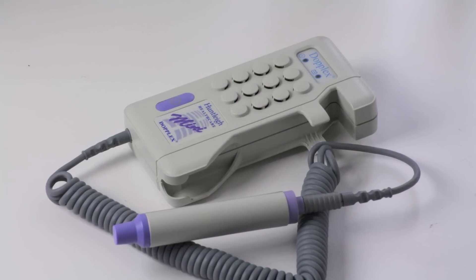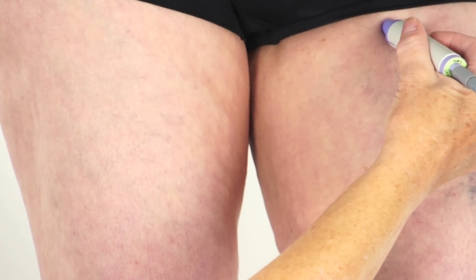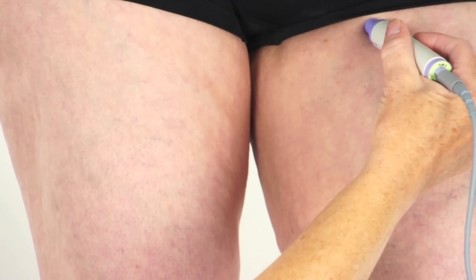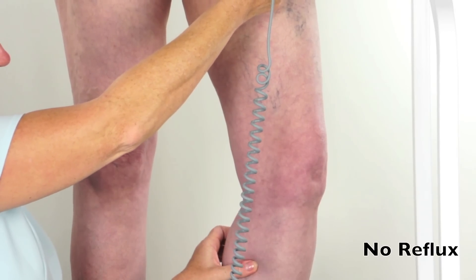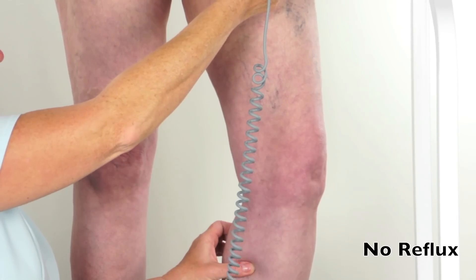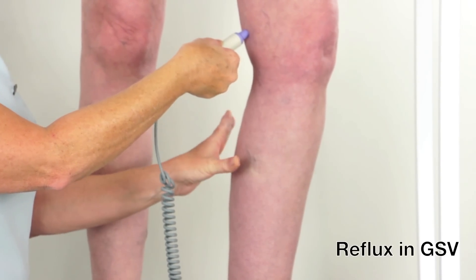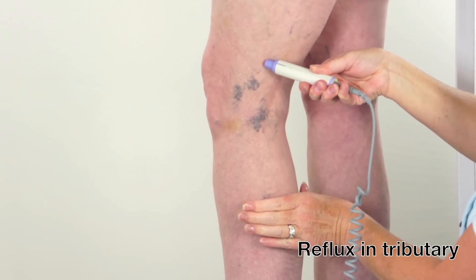I use a Huntleigh Doppler with an 8 MHz probe. Listening over the midpoint of the inguinal region, you can hear the pulsations of the femoral artery. As the probe is moved slowly medially, it will pick up the signals of the saphenofemoral junction and the great saphenous vein. When the calf is squeezed, an augmentation signal is heard indicating forward flow up the vein towards the heart. When the calf is released, any reflux is detected by another auditory signal.